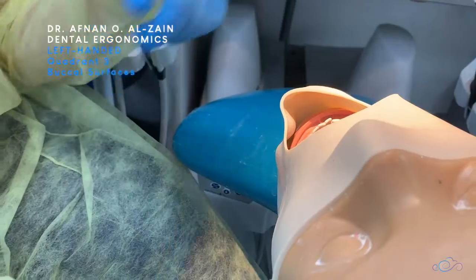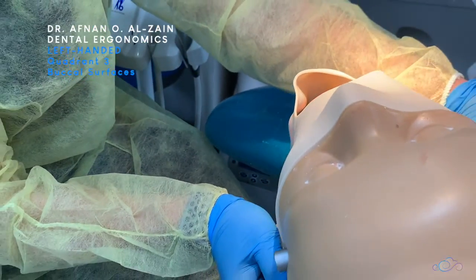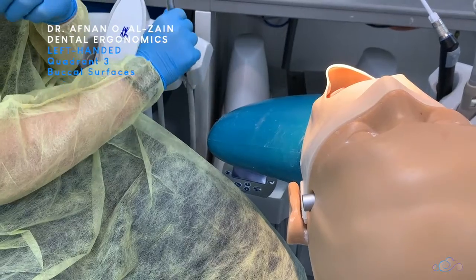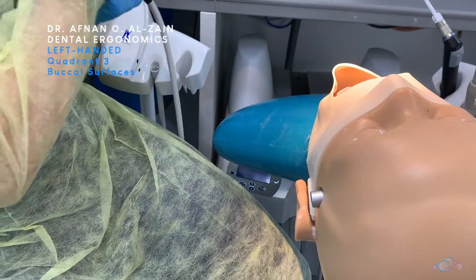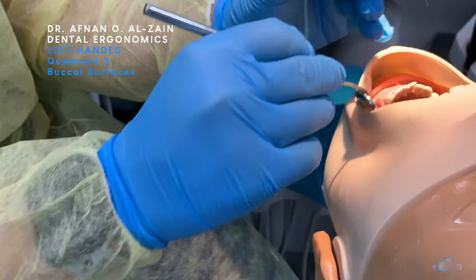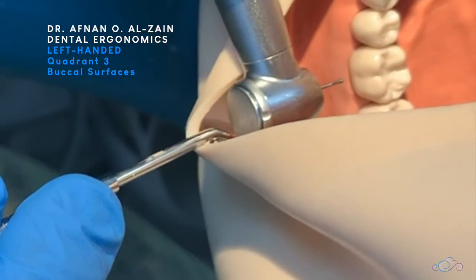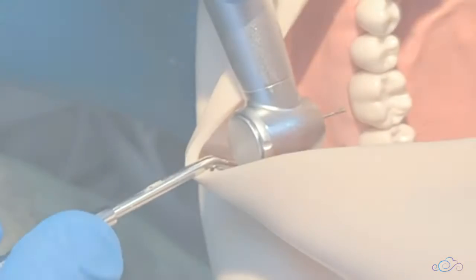Moving on to the buccal surfaces of quadrant three. When working on the buccal surfaces, you're going to tilt the patient's head a little bit to the right so you can see clearly, then you're going to retract the cheek or the soft tissue, place finger support on the alveolar bone or teeth, and place the burr perpendicular to the surface.